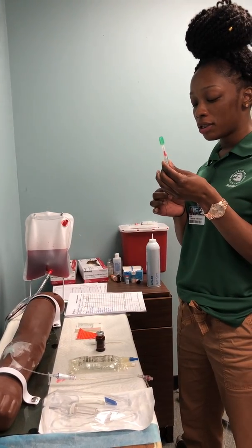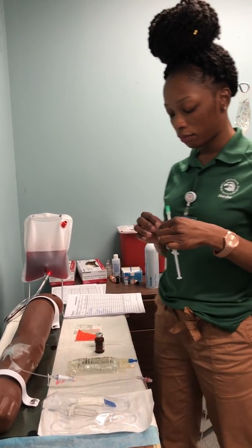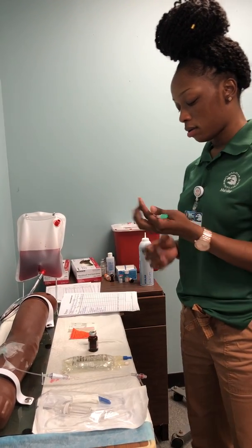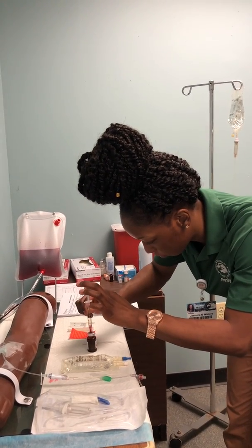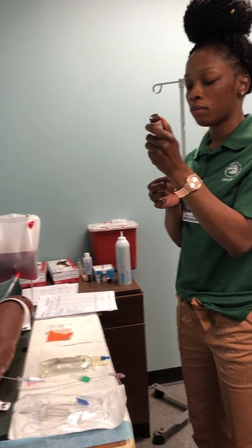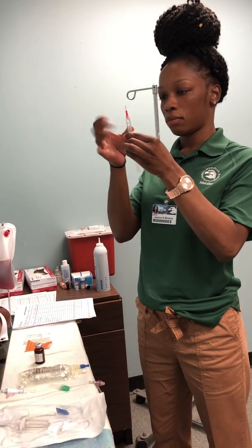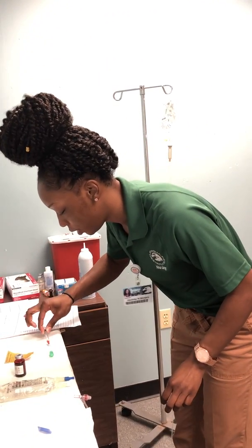I draw up 3 milliliters of air. I'll recap my Lasix.